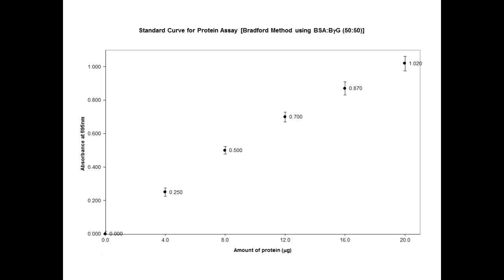Right? Not to say that we don't do yes or no, right? The same technology is used in pregnancy tests, and again, we really just only care, are you or are you not, right? So sometimes yes or no is enough. Other times we need quantitative values, right?